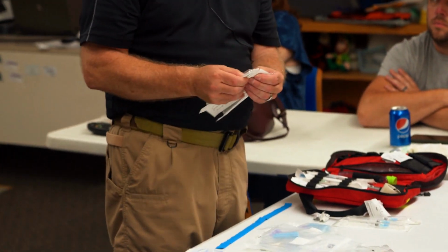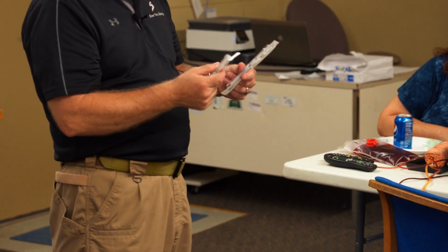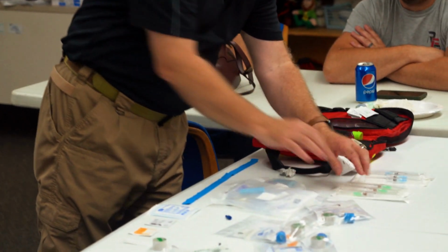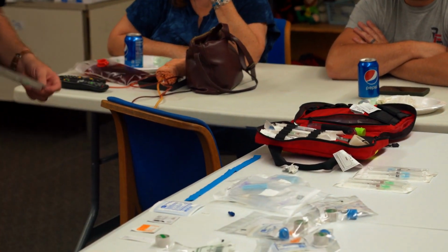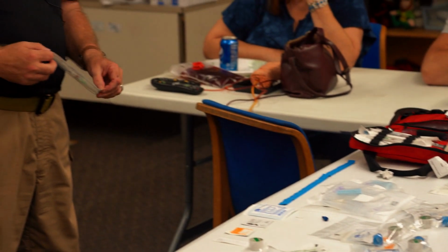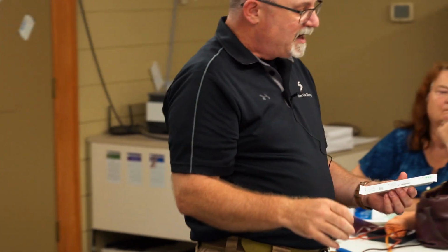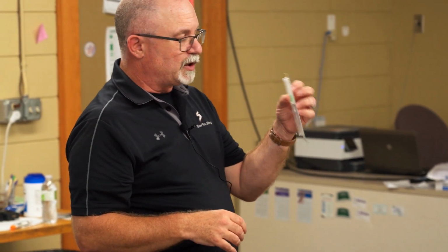So you guys are just carrying the 18 and a 22? Okay, all right. Three of each in each bag. So this is your IV catheter setup. They're color coded, and I haven't seen any variations other than the gray, so orange, gray, green, pink, blue, yellow. Different manufacturers. At one point, 20 years ago, we got an odd brand in there, but they're going to be color coded, so they're pretty easy to do.